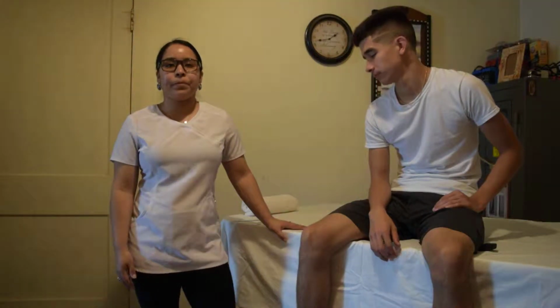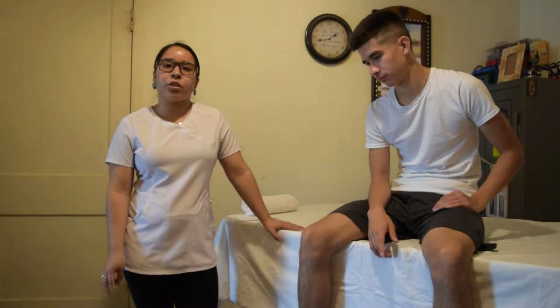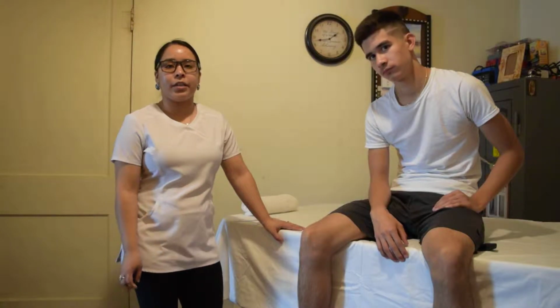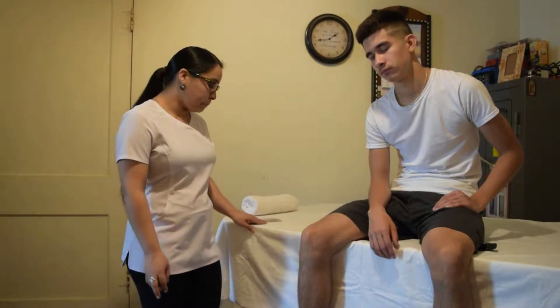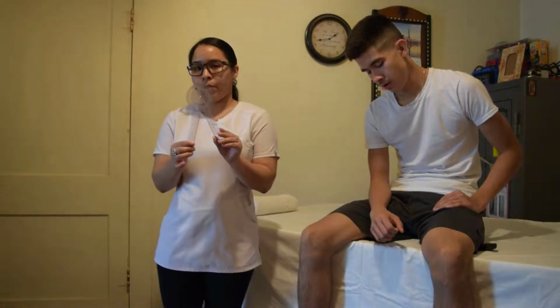And I'll be going over goniometry and flexibility. I will be conducting a goniometric measurement of the knee flexion and extension. Goniometry is performed with a goniometer. This here is a goniometer. The goniometer is a tool that physical therapists use to measure range of motion for various joints around the body.